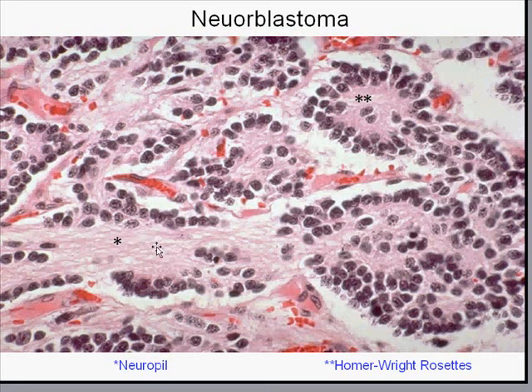You see these fine little strands in here? This is a good slide. This is neuropil. What these are basically are unmyelinated fibers, axons, dendrites, and if you do a good stain you can see it's not just pink cytoplasm, it's fine spindly stuff. Of course that could be better seen on EM.